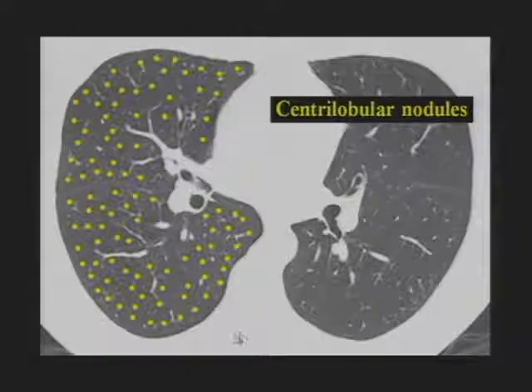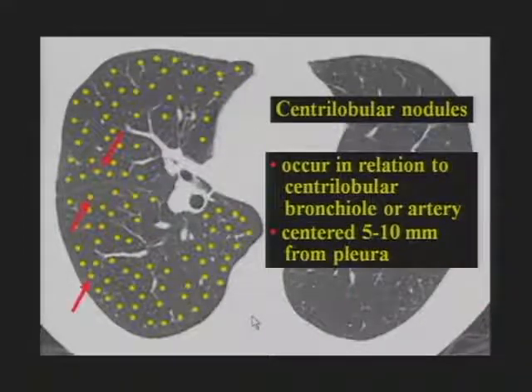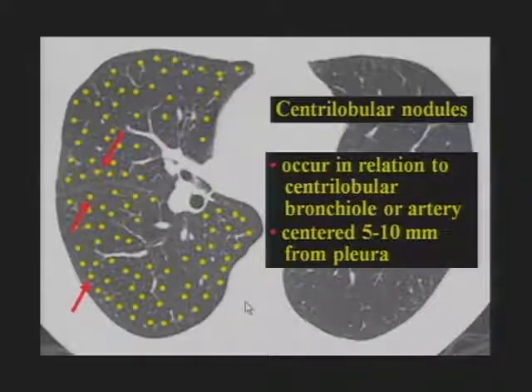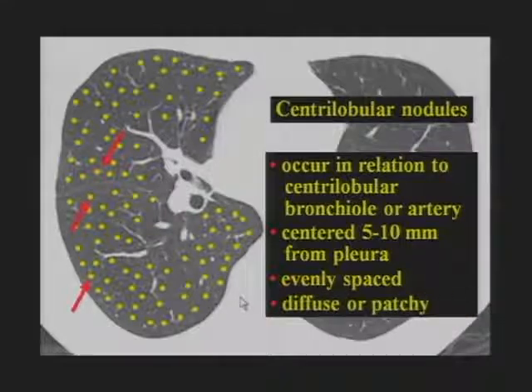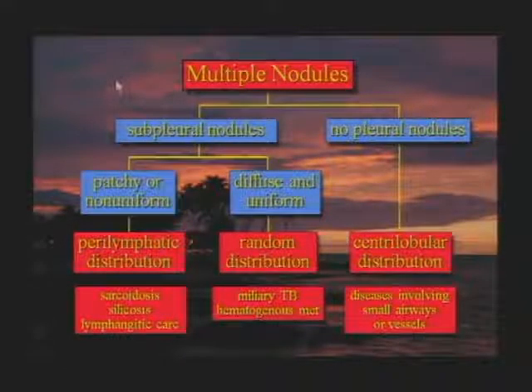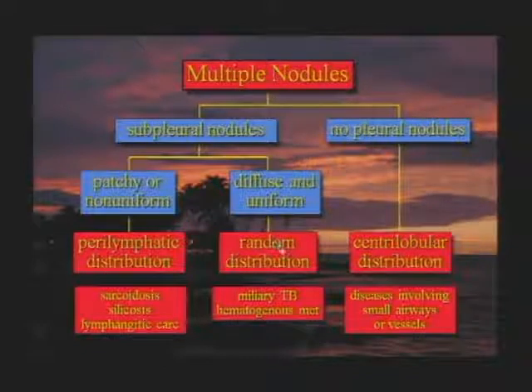The third pattern is centrilobular: nodules occur in relation to the centrilobular bronchiole or artery. The most peripheral nodules adjacent to a fissure or chest wall are about five millimeters from the pleural surface — where the centers of lobules are. Because lobules are about the same size, the centrilobular pattern appears diffuse and uniform. But with this pattern, you do not see nodules at the pleural surface as you do with a random pattern. A quick algorithm: no pleural nodules — centrilobular distribution; subpleural nodules with diffuse and uniform involvement — random pattern (hematogenous disease); subpleural nodules with patchy or non-uniform distribution — perilymphatic (usually sarcoid).